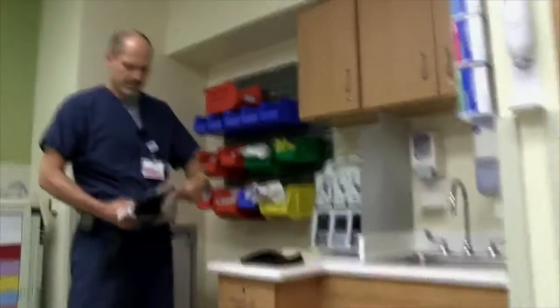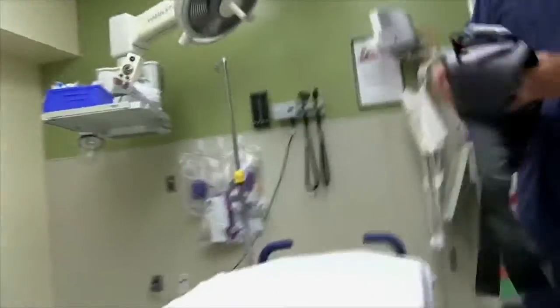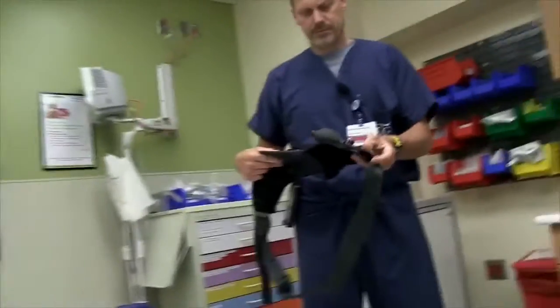So we're going to actually do a little interview here and a demonstration on how to set up this abdominal tourniquet. Dr. Schwartz is actually the inventor. This device was actually invented by myself and Dr. John Crouchhorn.